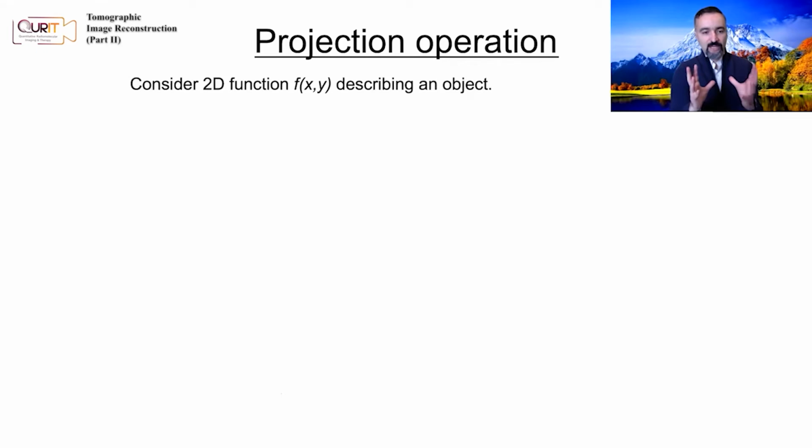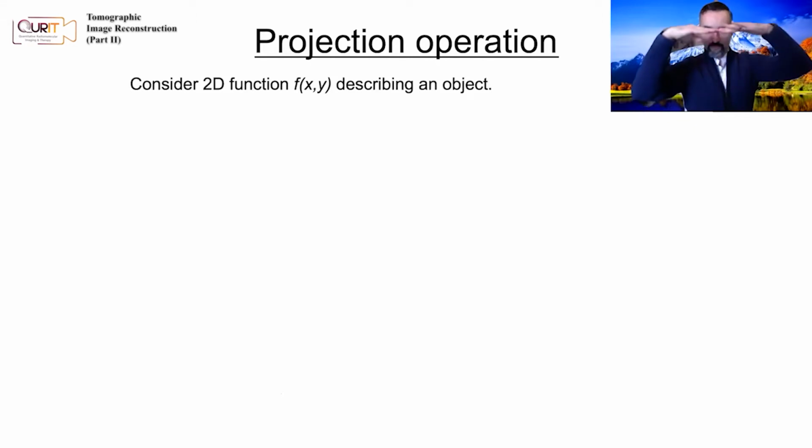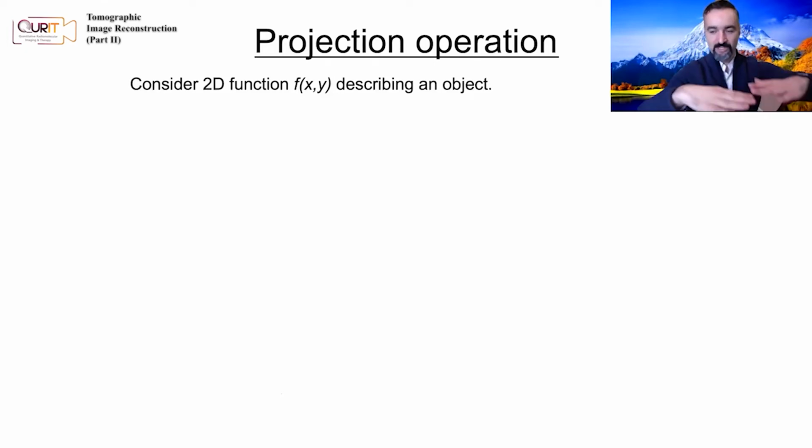For the purpose of this lecture, we're going to focus on a slice through the body. Of course, our body is 3D, but let's just focus on a 2D slice, and ask whether we can reconstruct a 2D slice. We're not going to focus on the axial dimension, though it can totally be extended. If you are able to do this for one slice, then of course you could do it for the other slices. And even if you have oblique angles axially, as we have in 3D PET, these formalisms can be extended. But to keep the discussion simple, let's focus on a 2D slice in the body.